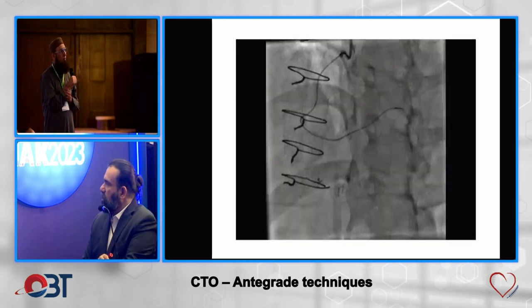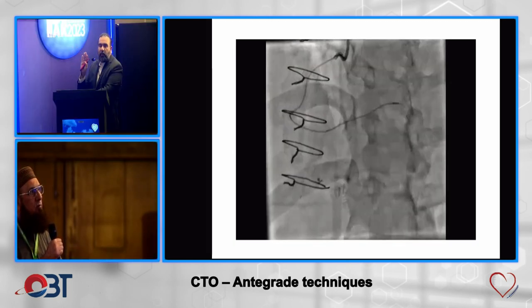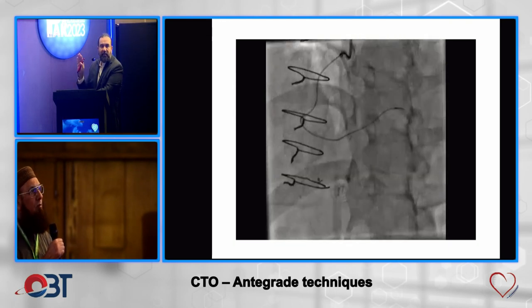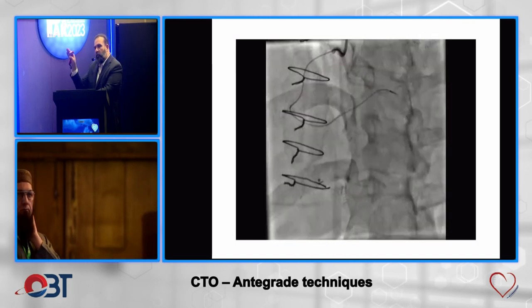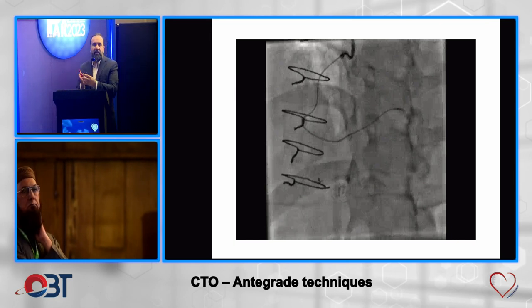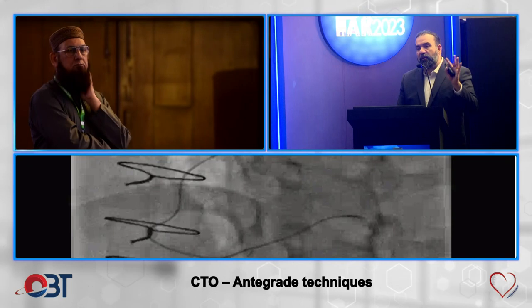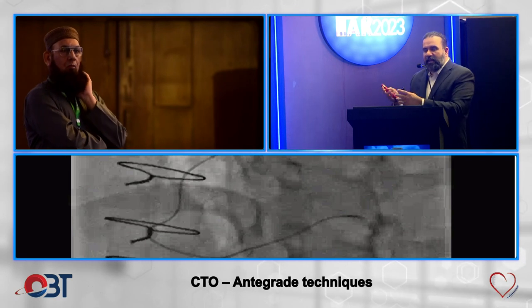Okay. So, and then this is the distal and then, okay, catheter bumping. And this is something I would say an over-the-wire balloon has a difficult time doing because it cannot navigate all the tortuosity and get through there. Especially where the wire had popped through, there was still some resistance, but you can drive the microcatheter down, you can torque it in. And because it has a tapered tip, this is about 1.4 French, this is about 2.3 French. As the microcatheter goes, it actually starts stretching it out. And once the microcatheter passes, then you can actually get a 1.5 or a 1.25 balloon in there. So one of the nice things about the microcatheter is it actually acts as a channel dilator.